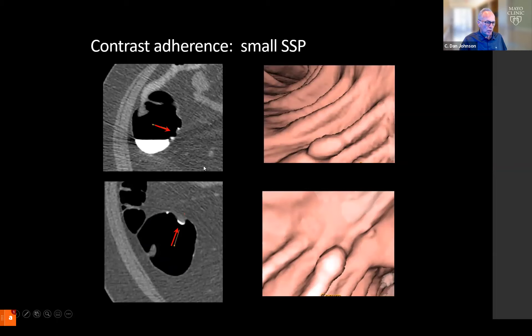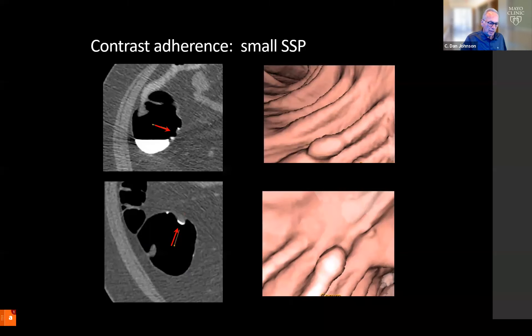Here are a few other lesions. Here's one that's relatively flat and has a barium cap. Another one that's small, flat, and has a little bit of barium on its surface that helps us identify these. Looking for that barium cap can be a really good tip-off that you might have one of these lesions present. It's the mucin on the surface of these lesions to which the barium is adherent.